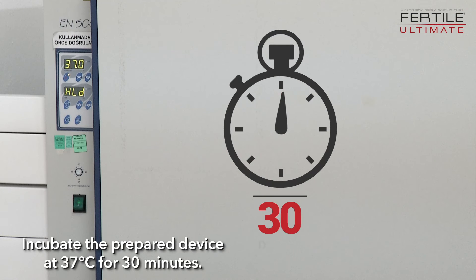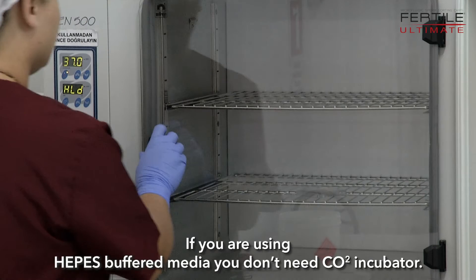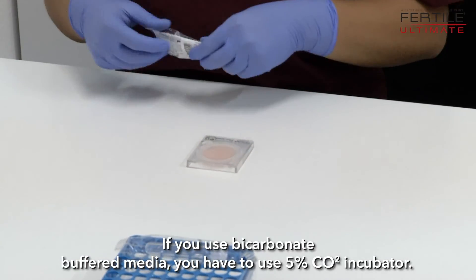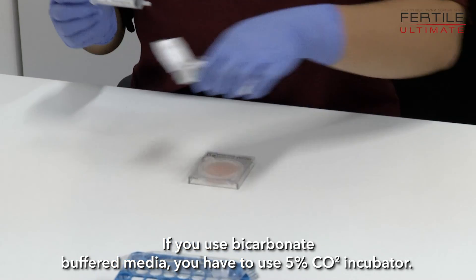Incubate the prepared device at 37°C for 30 minutes. If you are using HEPES buffered media, you don't need a CO2 incubator. If you use bicarbonate buffered media, you have to use a 5% CO2 incubator.